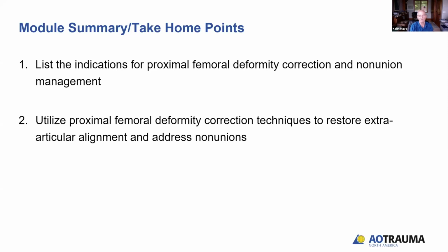Now that's multiple degrees of difficulty greater, because the last thing you want to do, after you've carefully done an open reduction, I'm assuming you've done an open reduction. In fact, they did not, but I would normally do an open reduction. So I've got a nicely reduced femoral neck, and now I'm going to pound on it with a seating chisel and then pound on it, putting a blade plate in. So I did it twice, and I never did it again.